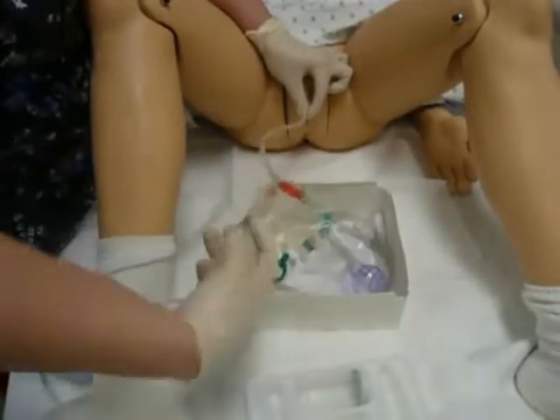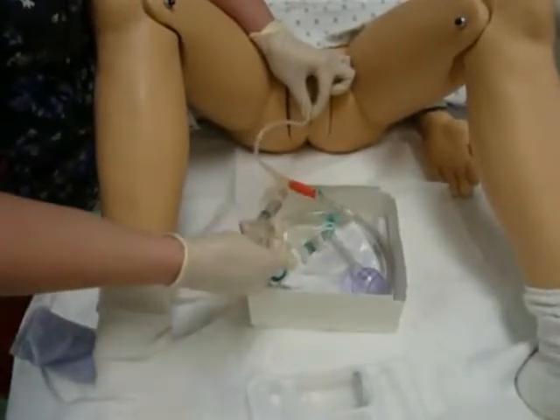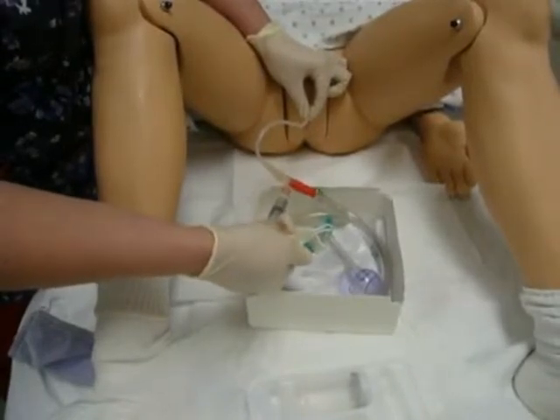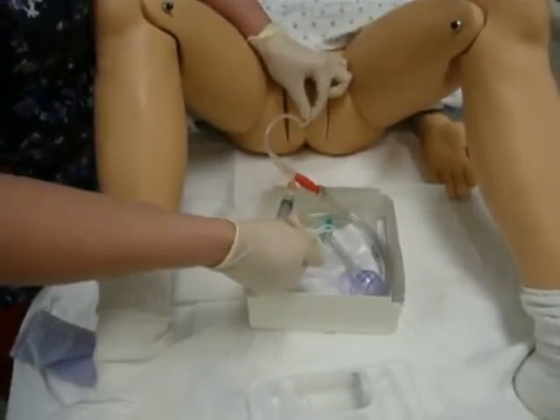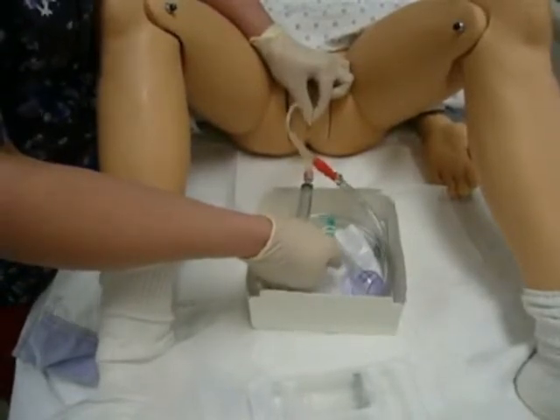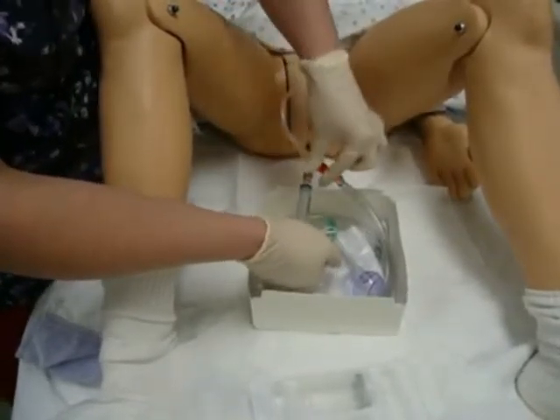I bring my thumb and first finger off of her and onto the catheter, and I inflate the balloon. Now when you start to inflate, you need to make sure that you ask them if they are having any pain. If they say no, you may continue to inflate.